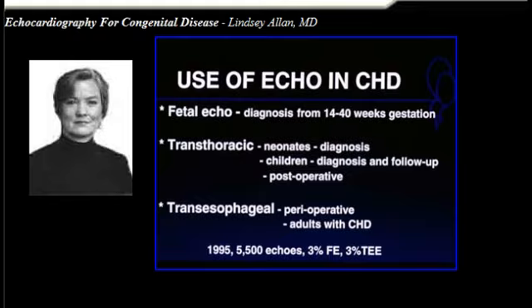The next modality we'll talk about is transthoracic echocardiography. In neonates, it's particularly important in terms of giving us anatomic diagnosis. In children, for diagnosis and for follow-up, not only for follow-up pre-op, before surgery, but also in post-operative follow-up.